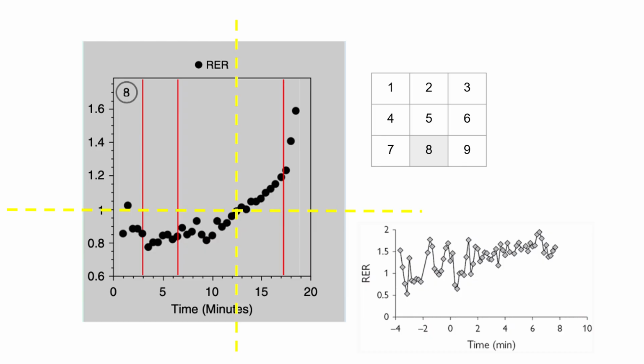The reason for this is that there is a buffering lag. Carbon dioxide is highly soluble, so there is a delay between when lactic acid is produced and when the carbon dioxide is actually measured at the mouth. Also, it's susceptible to volitional breathing. If a patient is very anxious and hyperventilates, then the RER will skyrocket to 1.1 or 1.2 within the first couple of minutes, long before they've actually reached a metabolic threshold.